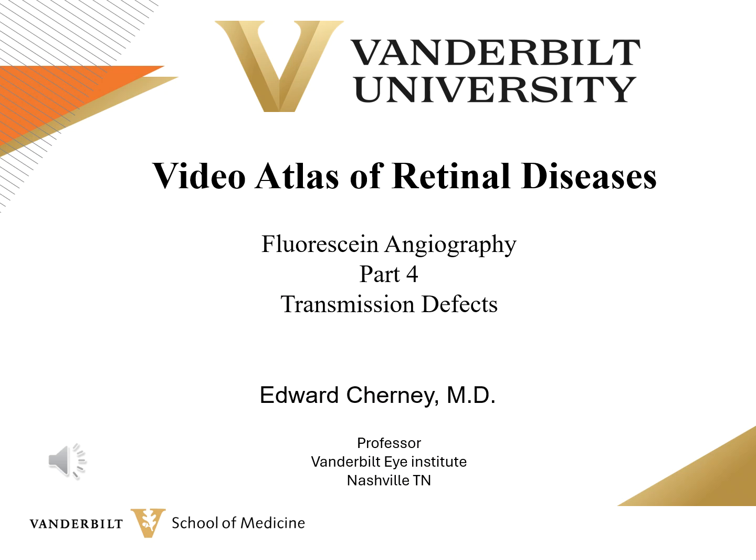You've already listened to the section on hypofluorescence, and now we're going to change and talk about hyperfluorescence. There are three main reasons for hyperfluorescence: transmission, leakage, or abnormal blood vessels. The transmission is where you are seeing normal fluorescence that is normally blocked, and then the other portion of hyperfluorescence is leakage coming from abnormal blood vessels that are normally present in the retina, but they're abnormal, or abnormal new blood vessels. And we've broken this down into two different sections.